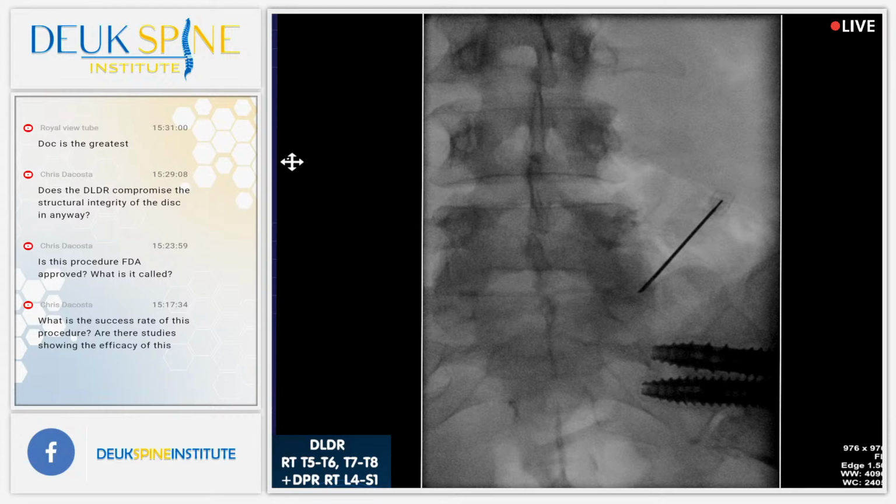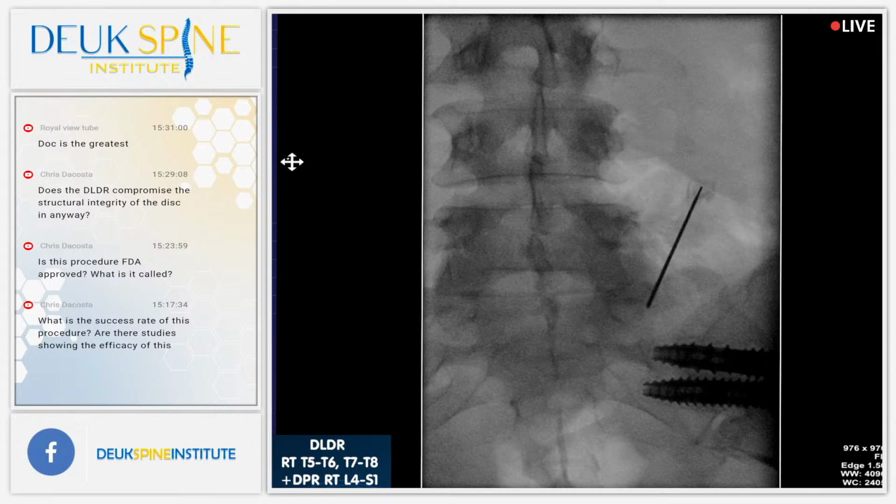We're going to shoot a chest x-ray and auscultate once we can get to the lung fields better. Standard. Are you concerned? Not at all, but you're asking about the lung fields. Absolutely. I cannot access them right now. Our sats are 99 and 100. Because the drape is too high. Through the front, the chest? She's in the prone position. Not as reliable. Okay. We're close. We're going to make a separate incision here. But we always check in the capacity too. No, I'm glad you do.